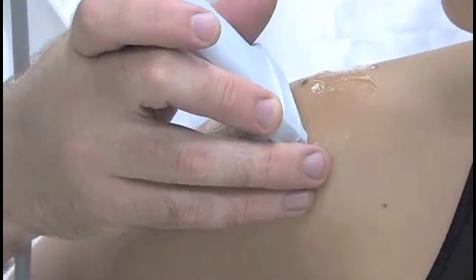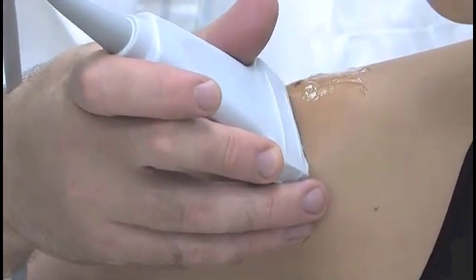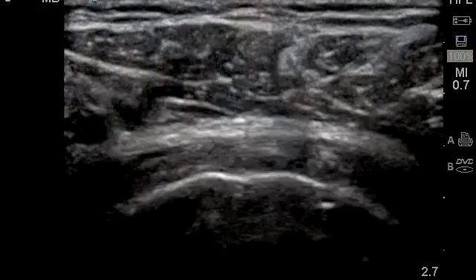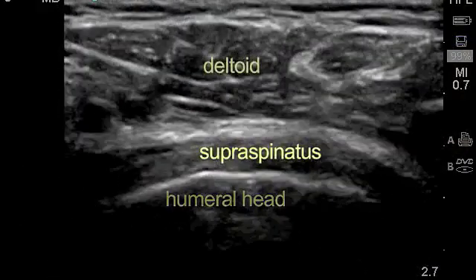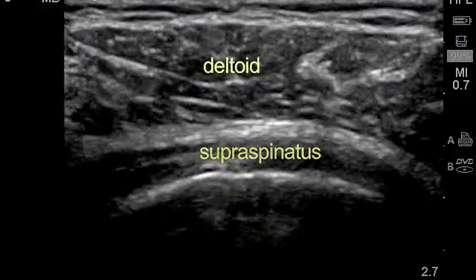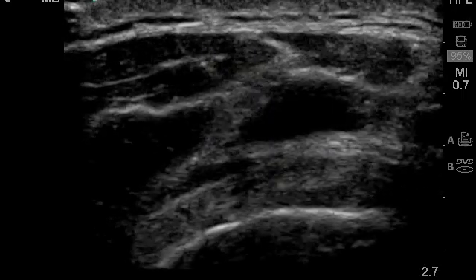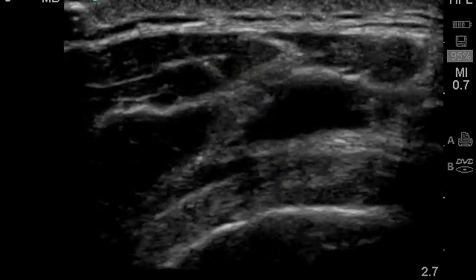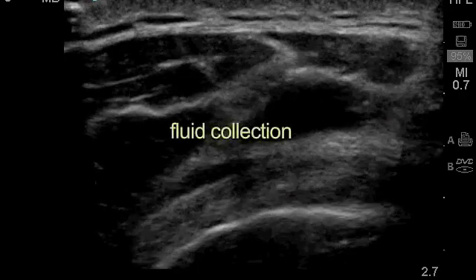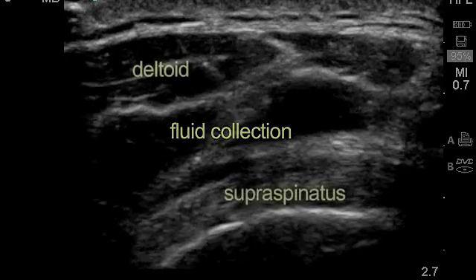Next, turn to a transverse orientation with the directional indicator facing the patient's back. In this orientation, the cortex of the humeral head, the supraspinatus tendon, and the overlying deltoid muscle can be visualized. Subacromial bursitis can be identified as a hypoechoic fluid collection between the supraspinatus tendon and deltoid muscle.